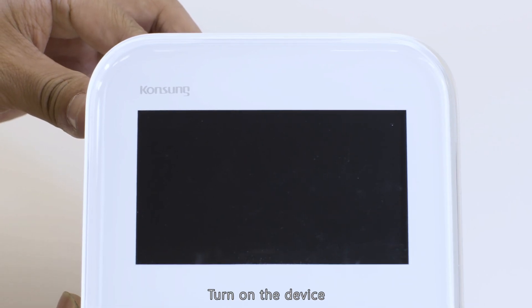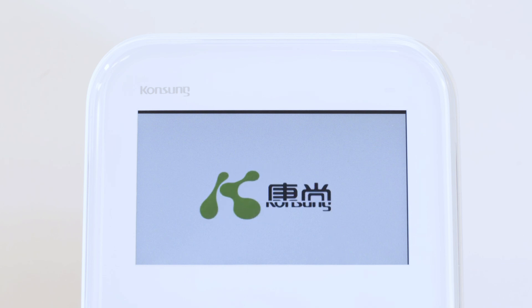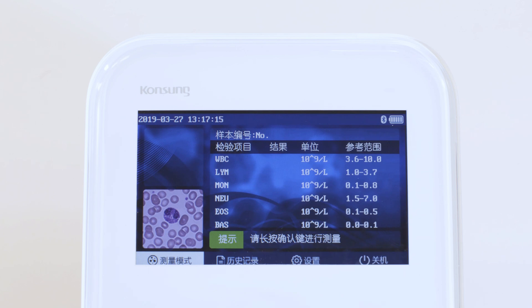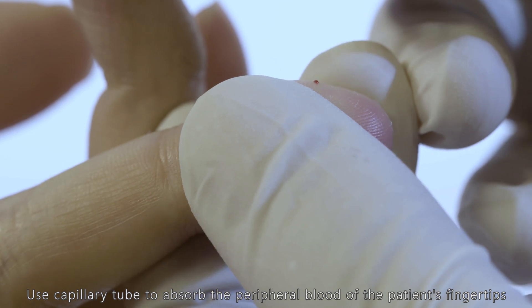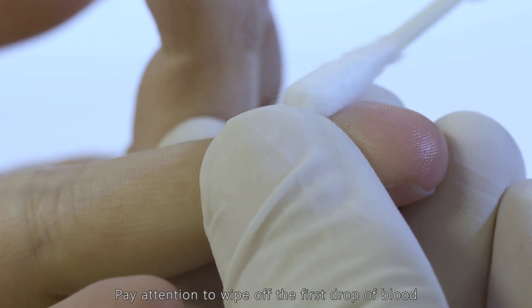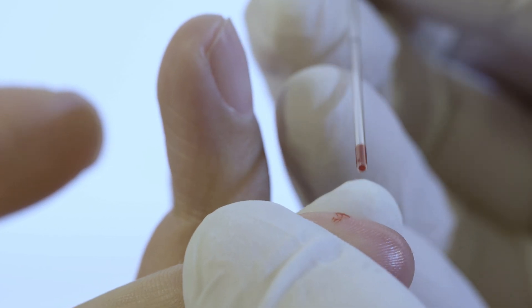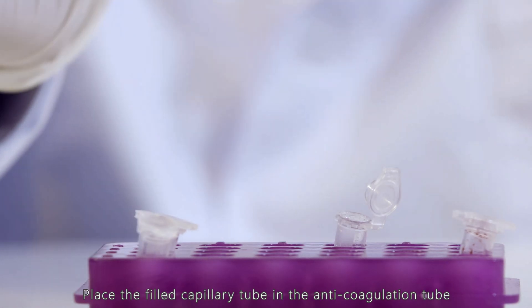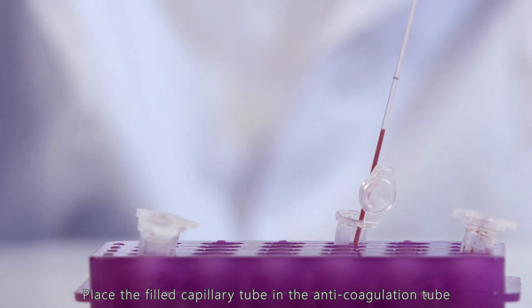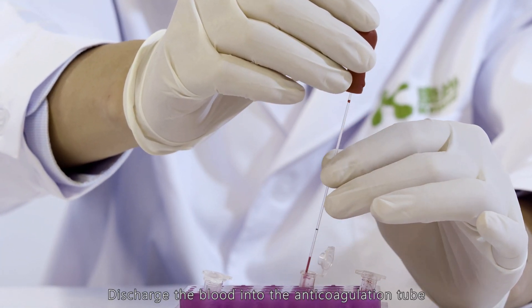Turn on the device. Use a capillary tube to absorb the peripheral blood from the patient's fingertips. Pay attention to wipe off the first drop of blood. Place the filled capillary tube in the anticoagulation tube and discharge the blood into the anticoagulation tube.